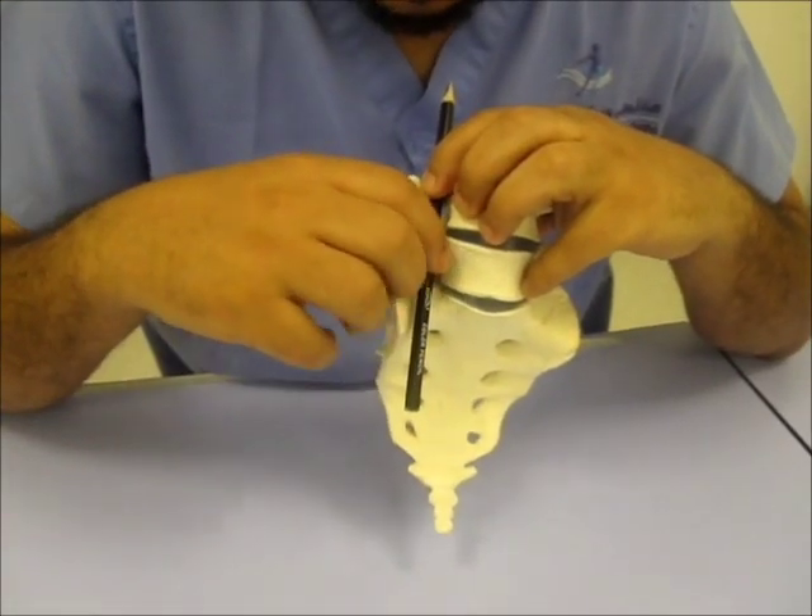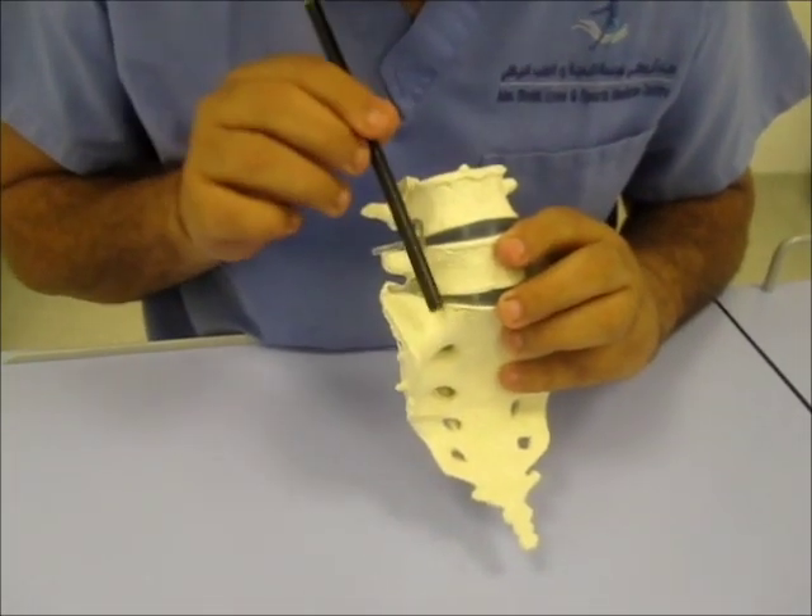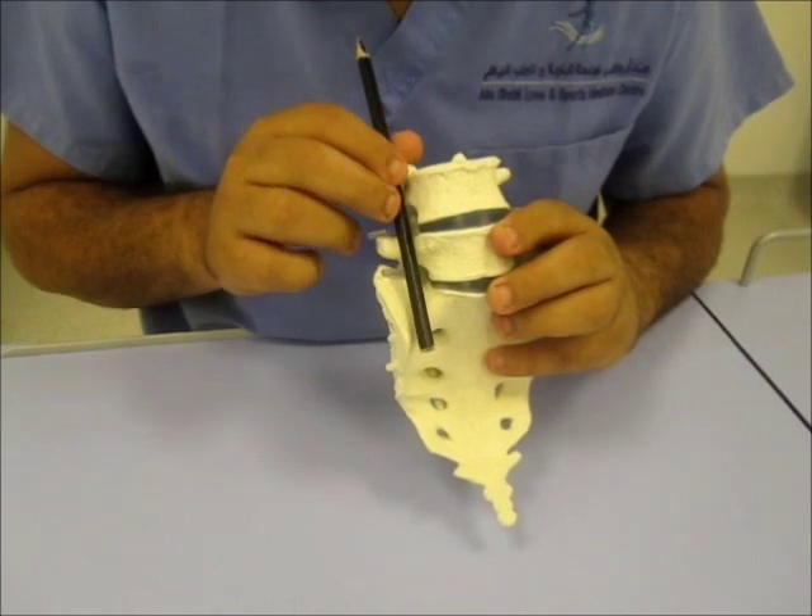This pen represents the Lumbar Plexus. It lies anterior to the transverse process and just lateral to the body of the vertebrae, within the psoas muscle.